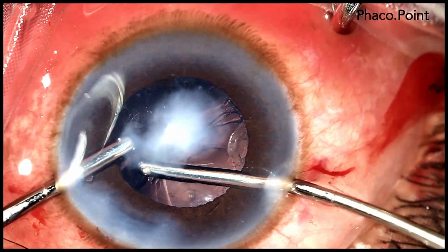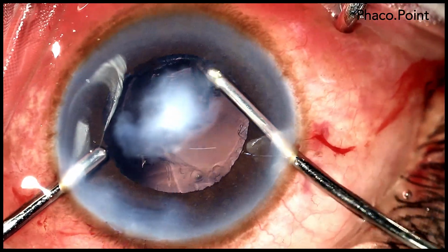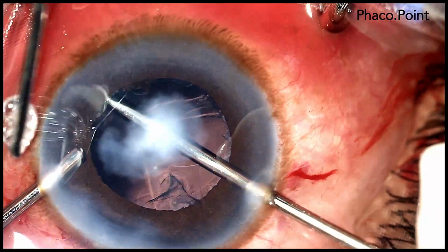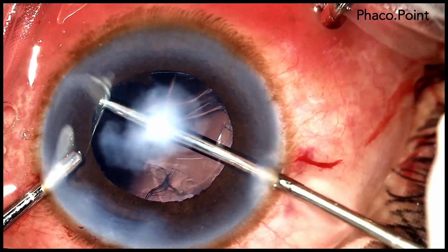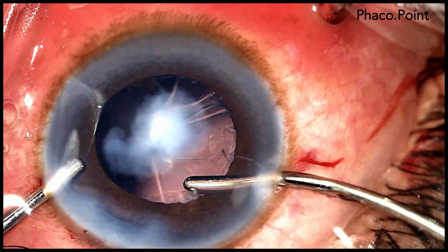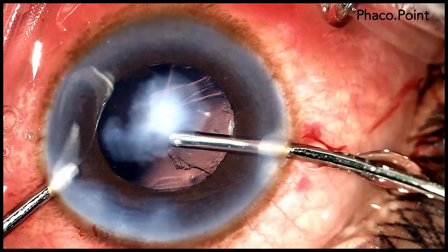The corneal opacity in this case does not extend up to and beyond the pupil in the periphery, thereby making the removal of the cortex fairly easy, because we are able to hold on to the cortex under direct visibility, draw it to the center prior to aspirating it from all around.